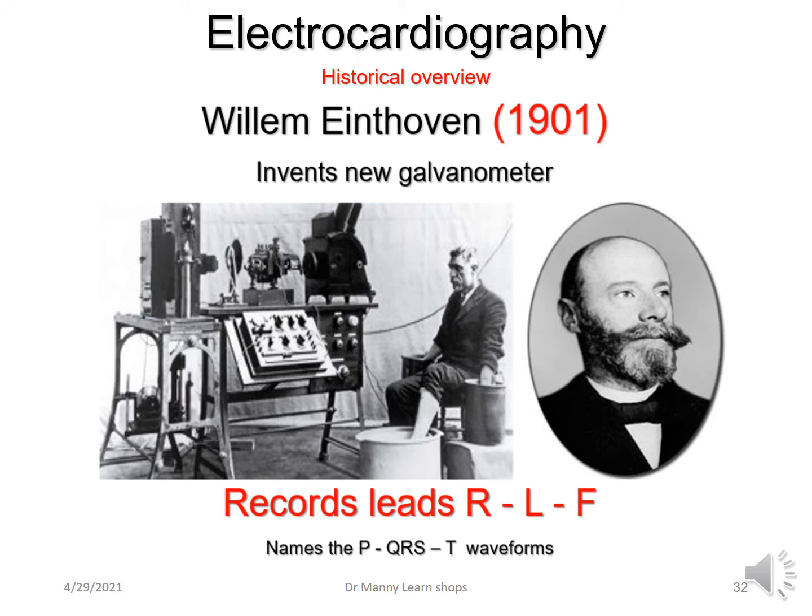And he named them the PQRST waveforms. And he didn't name them for any particular reason. He just had no choice. Initially, he wanted to call it 1, 2, 3, 4, 5. And then he decided A, B, C, D, E. But the scientific community said he couldn't do that because these numerics and alphabetical figures had already been taken by other scientists. What was left for him was PQRST, and anything thereafter. He chose PQRST, and this represented certain components of the ECG, which we'll discuss later.